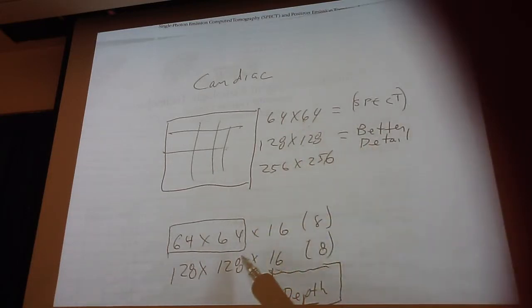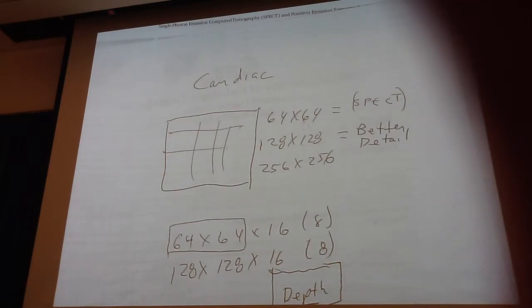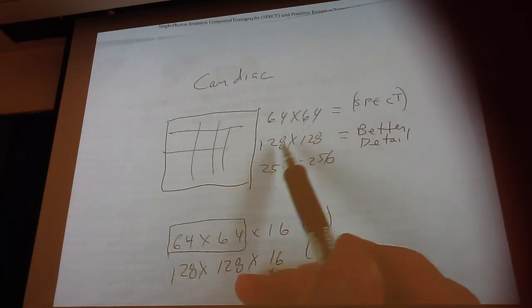Going back to that, if we did a bone scan on the pelvis and we did 64 versus 128, would we still get a better image with the 64 by 64, even though there were a lot of counts? Like you said, if there were a lot of counts, we'd use the higher matrix. Actually, if you're getting a lot of counts, then it would be better to use this. Like I said, it's all numbers.